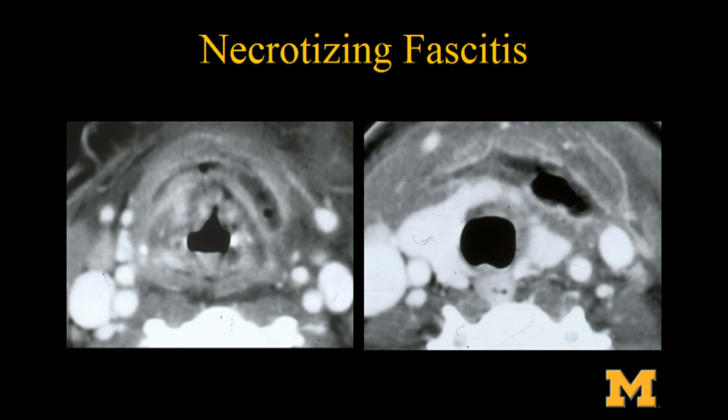You have, right? Because when the New York Times talks about necrotizing fasciitis, they don't call it necrotizing fasciitis, right? What do they call necrotizing fasciitis? Flesh-eating bacteria. This is the flesh-eating bacteria. And you can make a diagnosis on this, because if you see air in the soft tissues and the patient's never had surgery and they've never had radiation therapy or chemotherapy, this is necrotizing fasciitis.